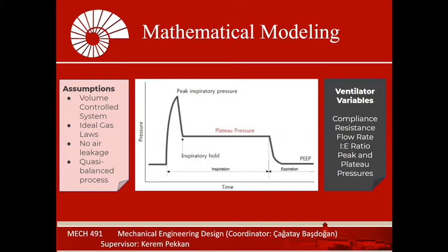Also, more importantly, there are airway compliance and airway resistance, which were the main quantities to calculate in the model. Very basically, resistance describes the opposition to gas flowing into the airways during inspiration, and compliance describes the elastic property of the respiratory system. This is crucial, since a wrong calculation could end up causing severe problems in the patient, such as bronchospasm, mucus plugging, and edema in the airways.